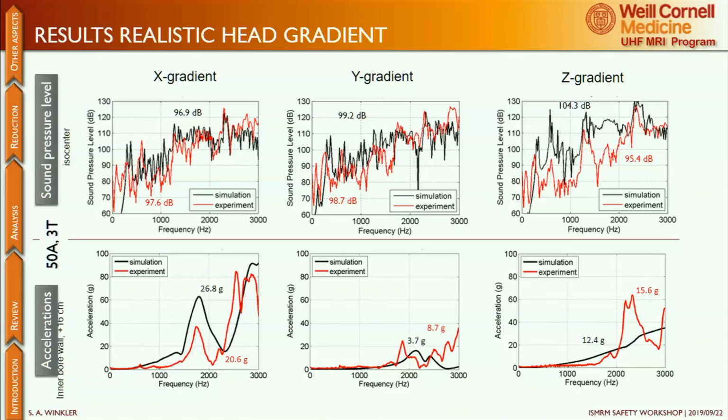If you also add ceramic on the outside, you can get to even further reduction, which was on the order of 30 dB. We didn't actually build this. It's kind of hard to do. So you have to pot your whole gradient coil into ceramic. I don't know if you want to do that easily. So another concept was kind of cute.